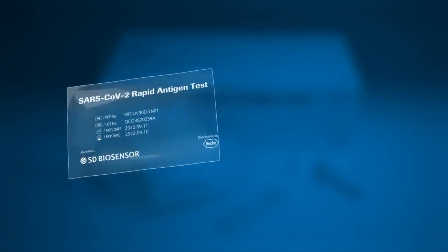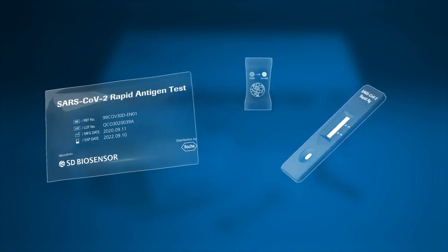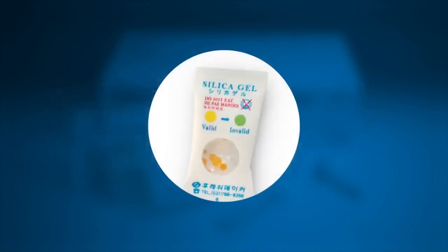Now open the foil pouch and remove the test device and the desiccant package. Take a moment to ensure that the test device is undamaged and that the desiccant status indicator shows valid yellow.